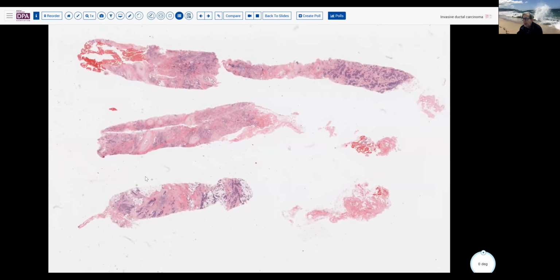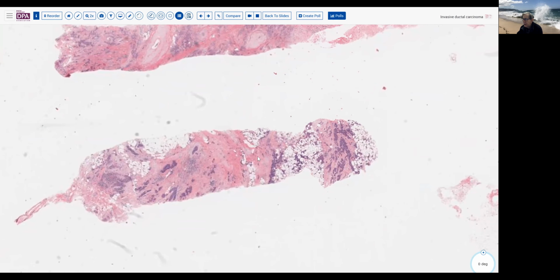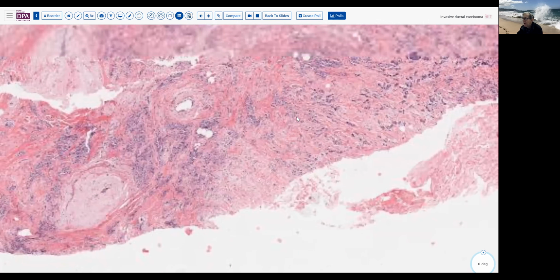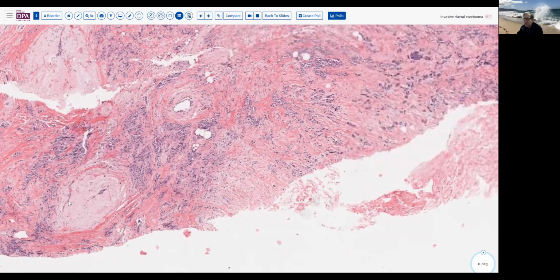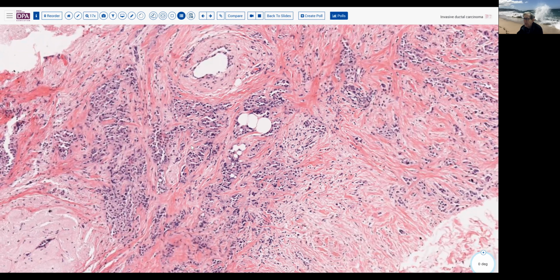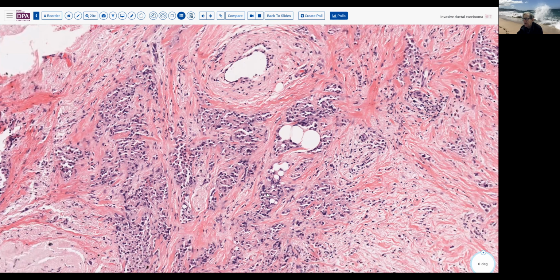Another tumor, another example. Lots of these are very straightforward to see a lot of times. You don't even have to go to high magnification sometimes. But you can see here we've got some solid areas down here. We have a little bit more diffusely infiltrative pattern up here that might look a little bit more like lobular carcinoma, because it looks like we have some sort of preserved ducts with some elastosis around them. But notice as we look at these tumor cells that they are forming small sheets and clusters. It's just that the fixation in this particular area was not as good.